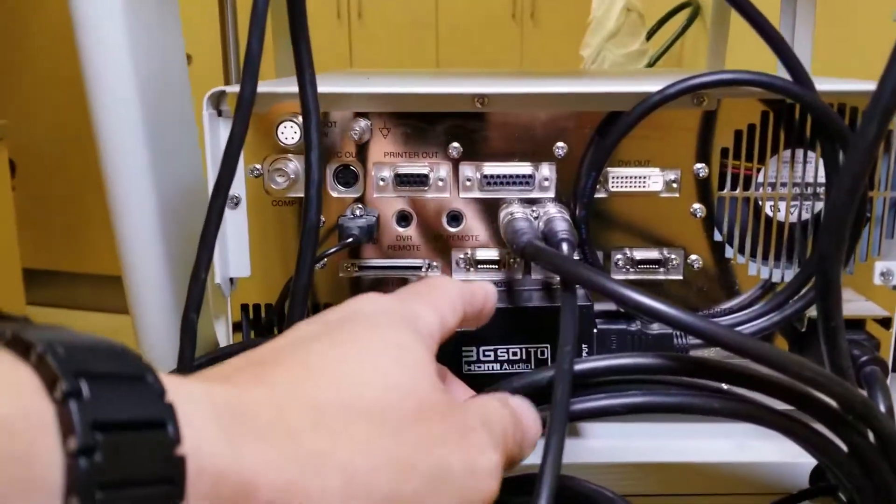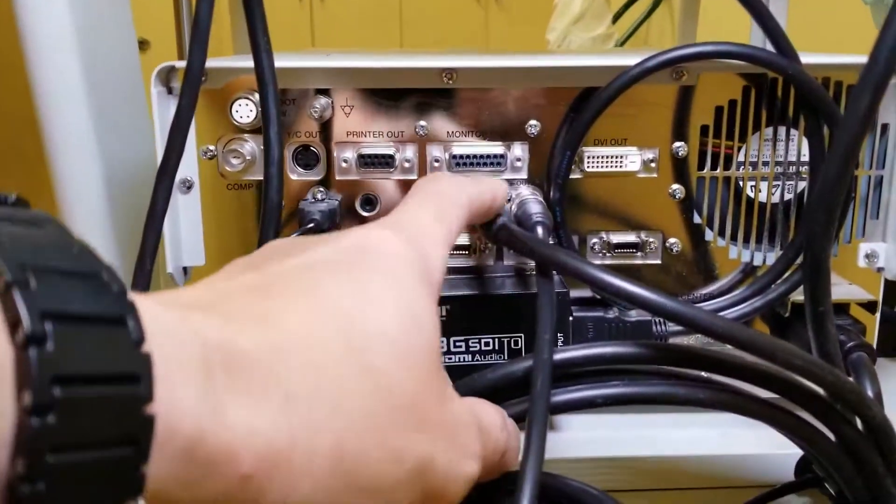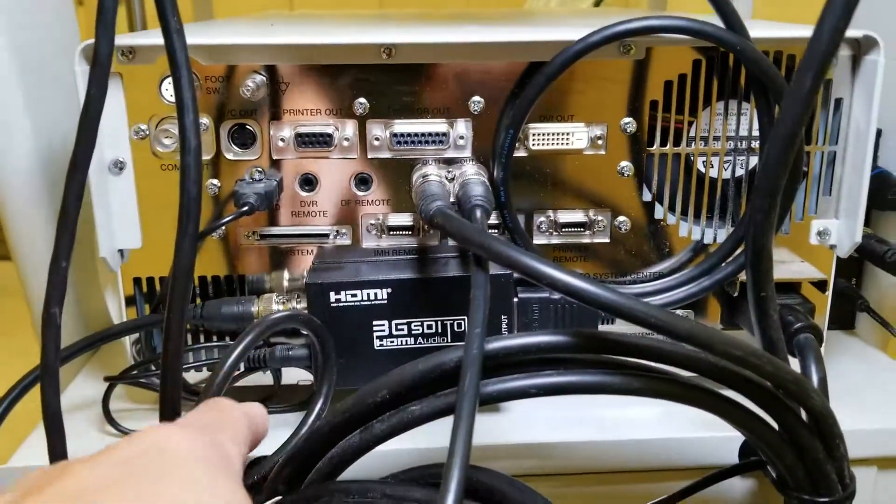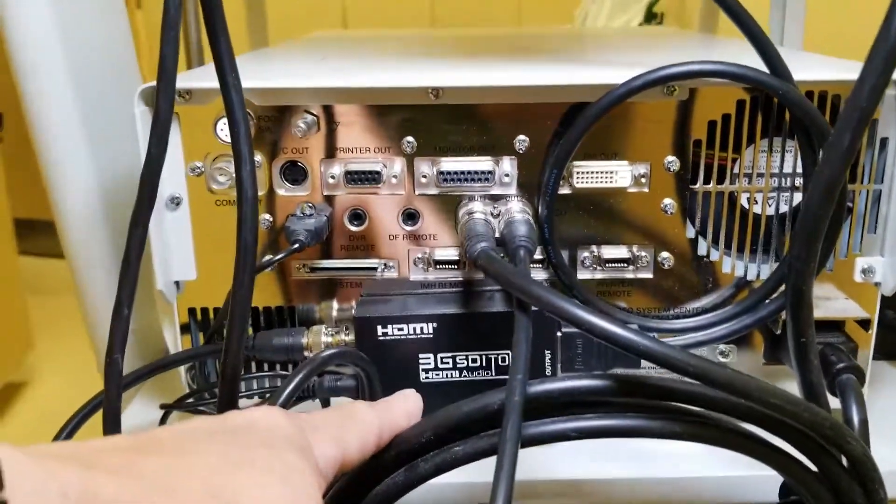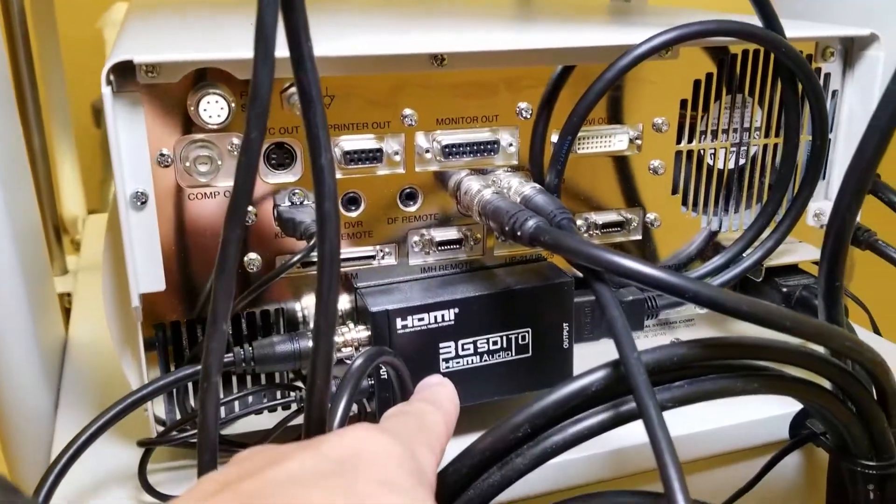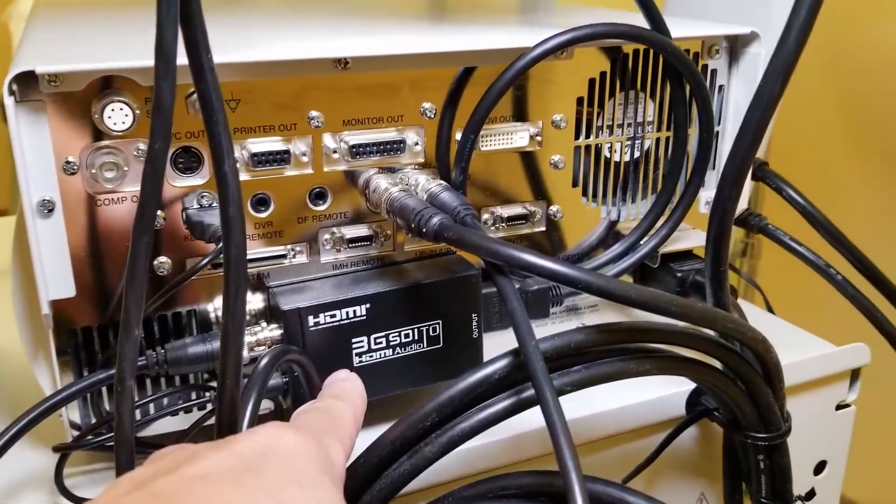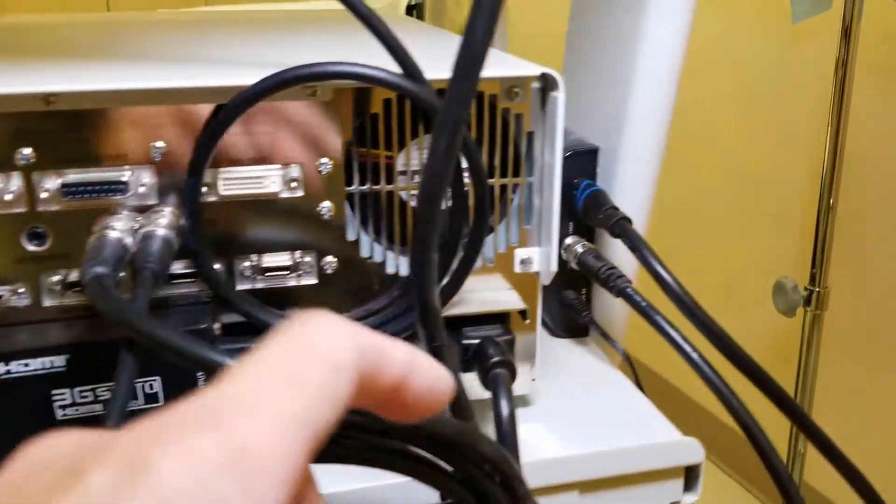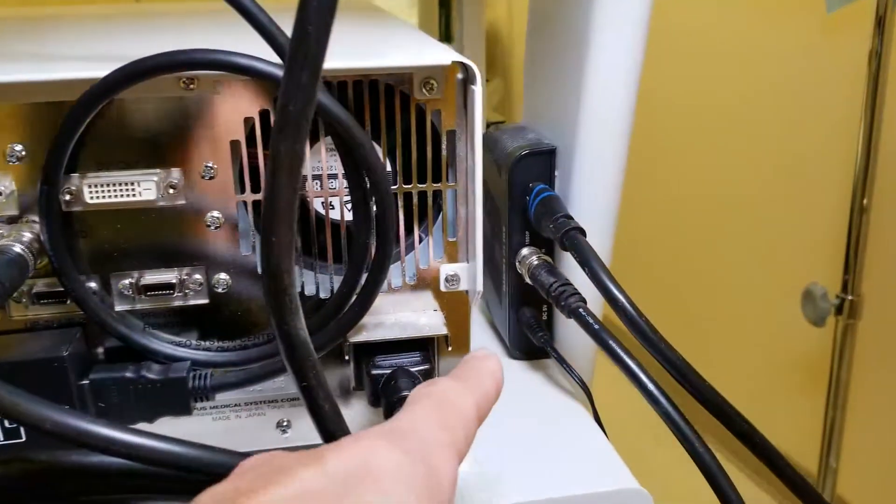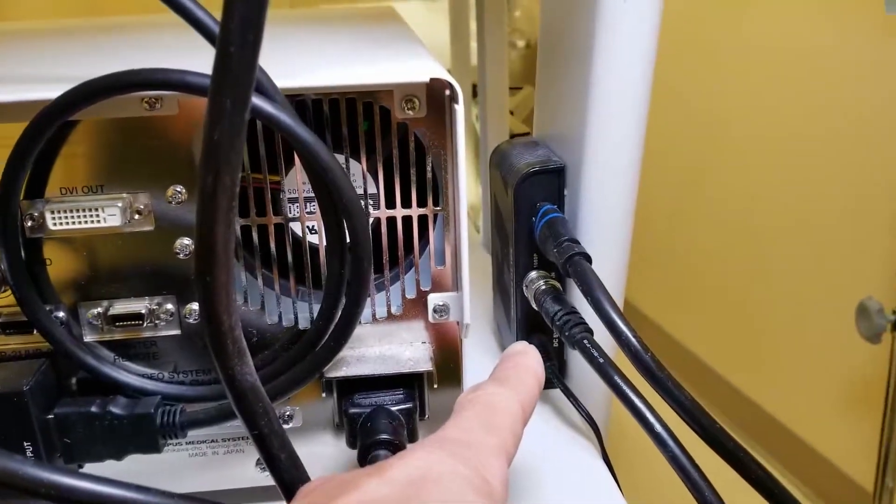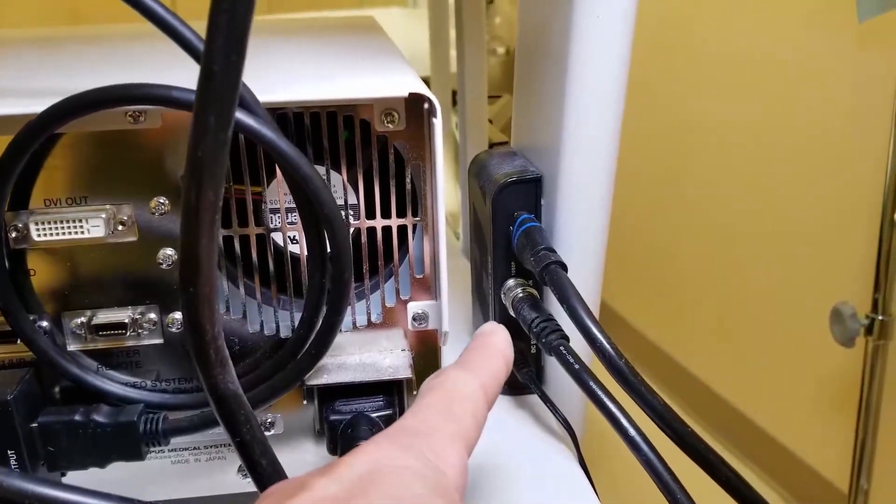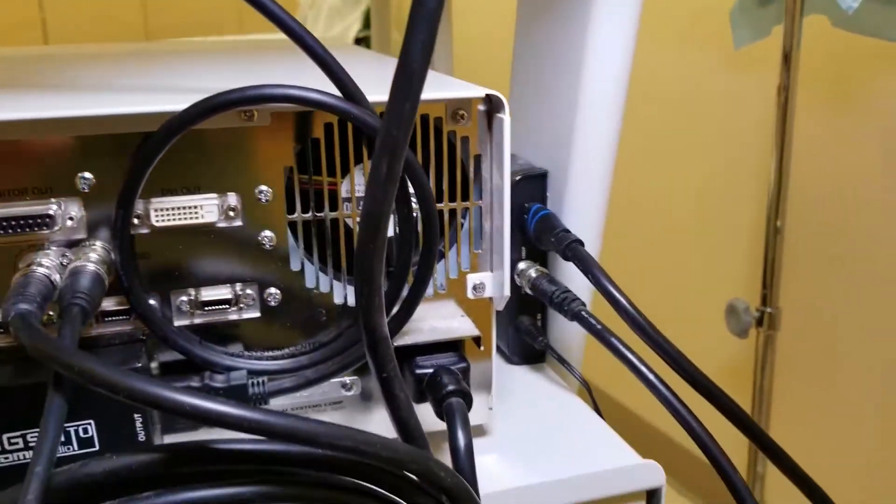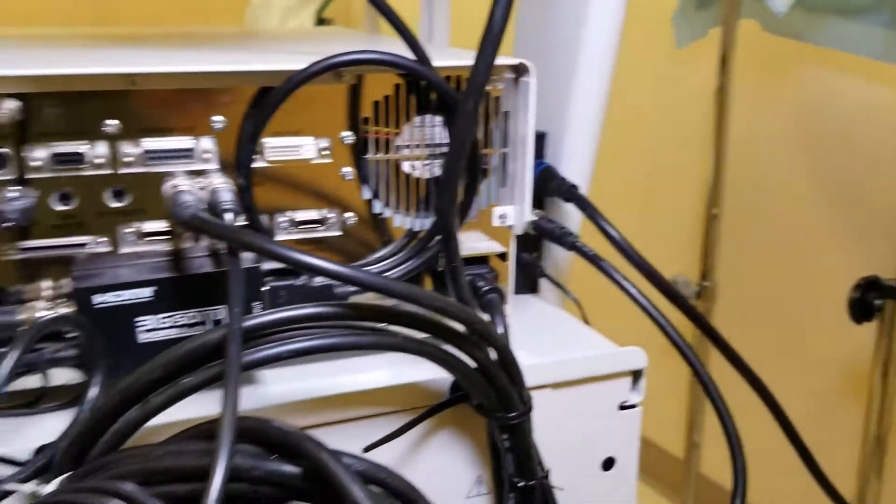You see two outputs here. One goes to this SDI to HDMI converter which I just installed today, and I have an older unit right there that supplies the signal going to the other monitor.